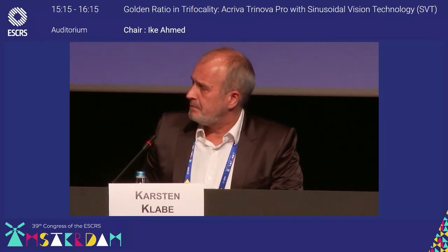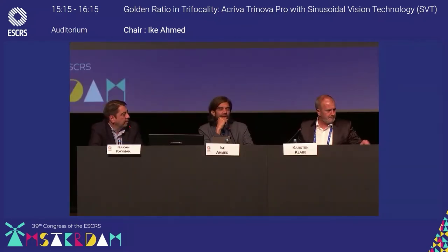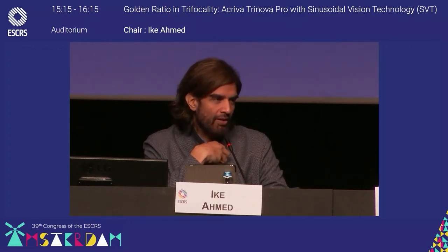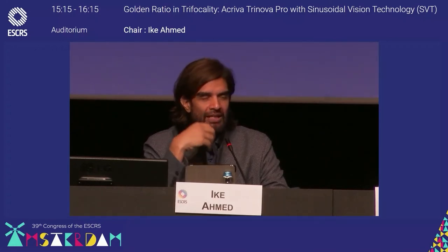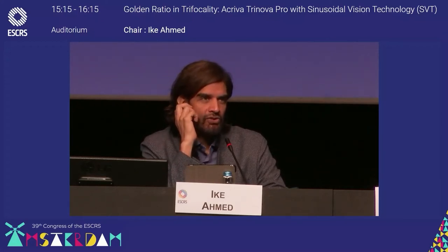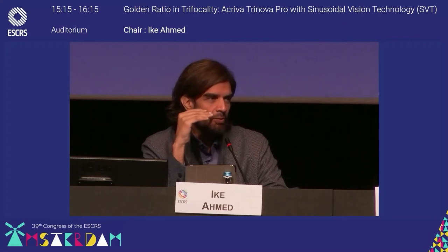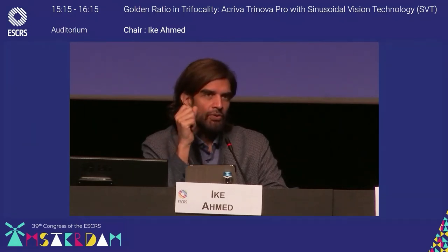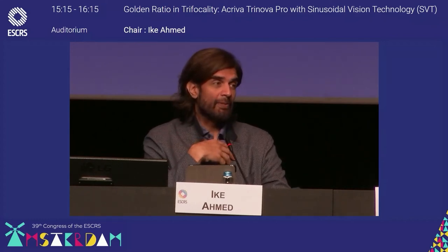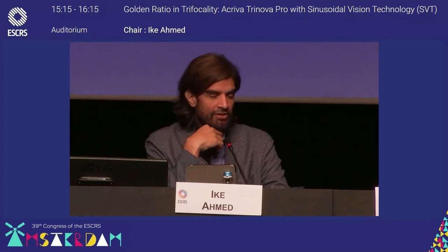It works well. I think there are a number of studies out there. In my personal opinion, I believe C-loop haptics are more stable, rotationally stable, but also axially more stable. If you think about the tension forces, the centripetal forces on the capsular bag with contracture, a plate haptic could flex more than a C-loop haptic, which is compressed inside. So I do think that's a benefit. And I think you see a lot of manufacturers going there. That's my own bias, my own personal feeling, and I think there's some data to support that as well.